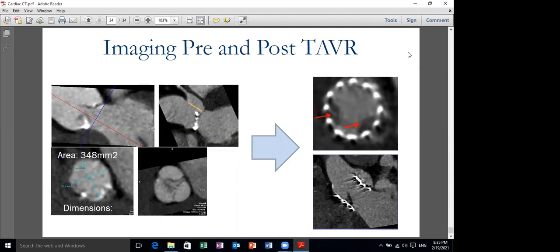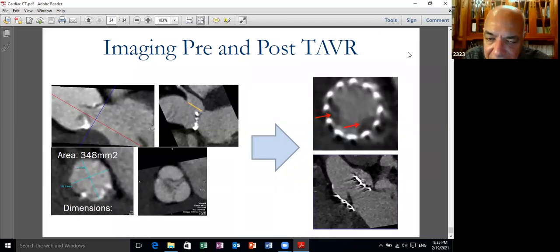However, CT in evaluating mitral regurgitation cannot detect the regurgitant jet, just delineation of the anatomy, masses, defect, their precise location, and tailoring intervention. Of course, CT PET is used in the diagnosis of bacterial endocarditis. This is a condition in which association with another imaging modality can help show the presence of inflammation, paravalvular abscess, or paravalvular masses. So echo is still the primary investigative method for the diagnosis of mitral regurgitation, aortic regurgitation, aortic stenosis, and so forth.